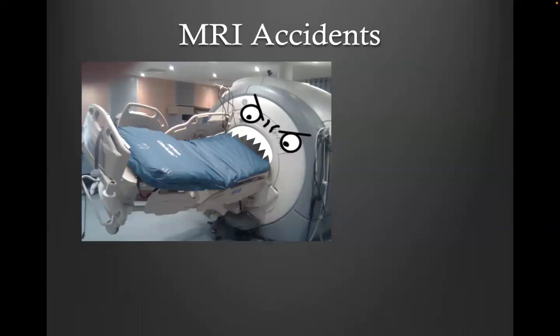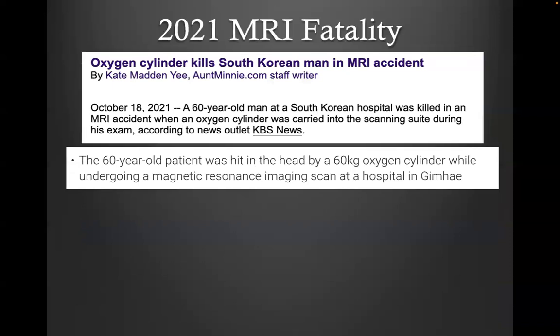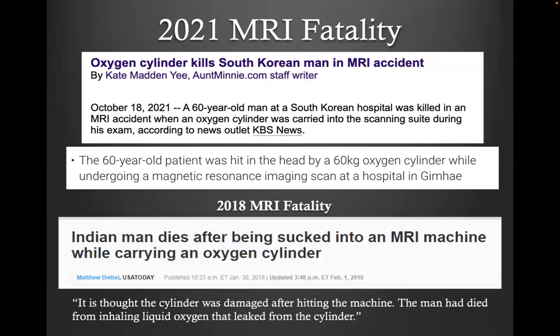For MRI accidents, if you do a Google search, you are going to see all crazy images of things getting stuck to the MRI. Believe it or not, these accidents are still happening. The latest fatality is in 2021: oxygen cylinder kills South Korean man in MRI accident. He was killed when an oxygen cylinder was carried into the scanner suite during his exam, and the oxygen cylinder just flew to the MRI.